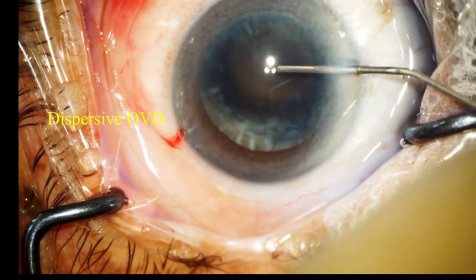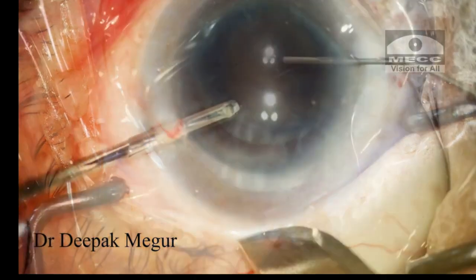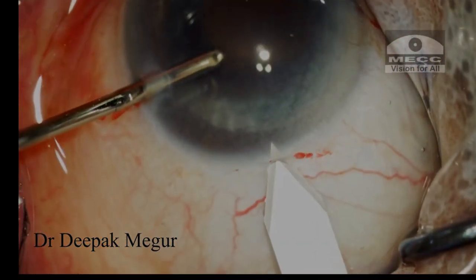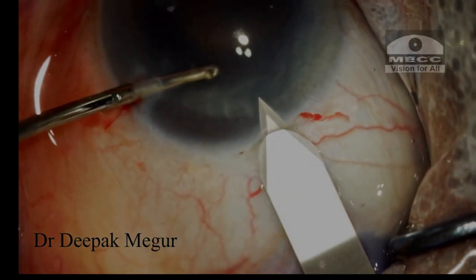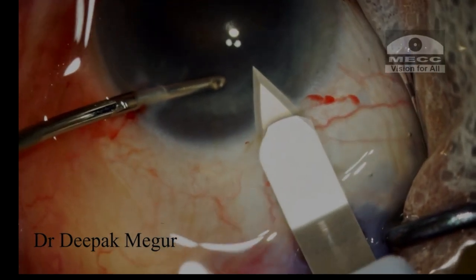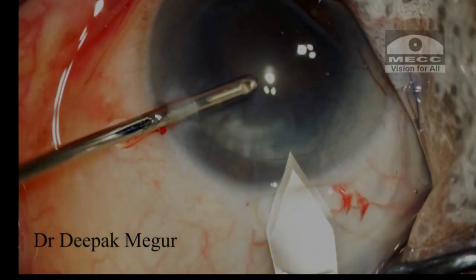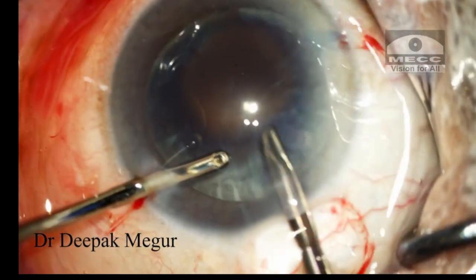The main 2.8 millimeter incision is created by stabilizing the globe with a second instrument through the side port and using a 2.8 millimeter bevel-up sharp keratome. My preferred incision is always a posterior limbal incision, as I find them safer, stable, and faster to heal.